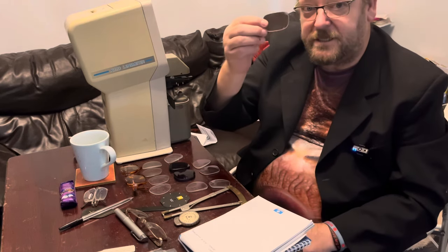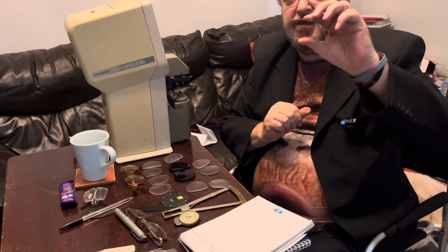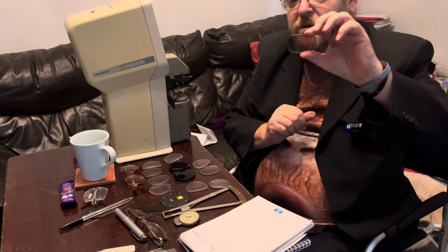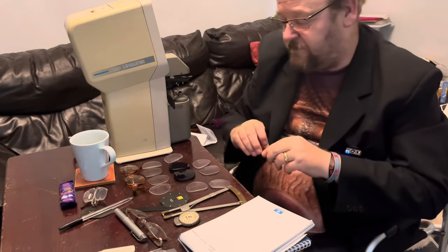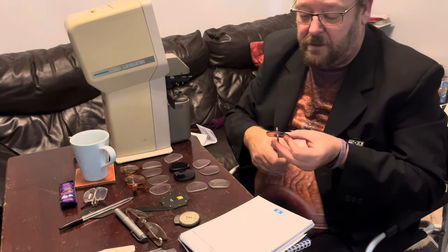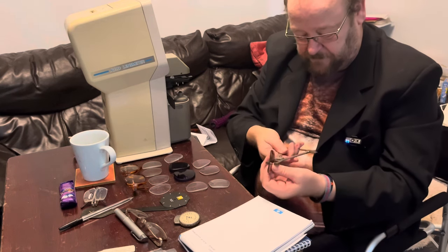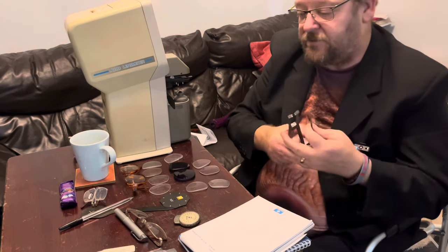So I'm starting off with this lens. It's a bifocal, it's got a slight tint — I'd say that's about a brown number one tint. My first measurement I'm going to do is the center thickness of the lens. I'll put that against the center and that's at three millimeters.